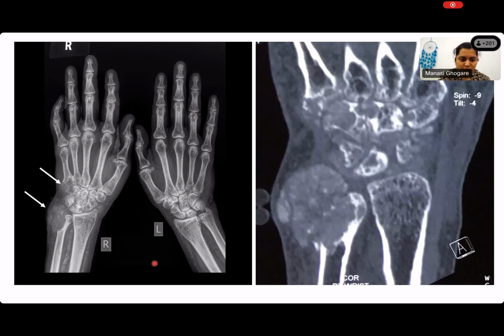So what does it show you? Multifocal. It's a lytic lesion which seems to be very moth-eaten. Don't you see that? It has not got a very good zone of transition. Here, yes, it's a scallop, which is a very clean zone of transition between the lesion and the bone. But what else do you see, particularly in this ulnar lesion? Areas of calcification.